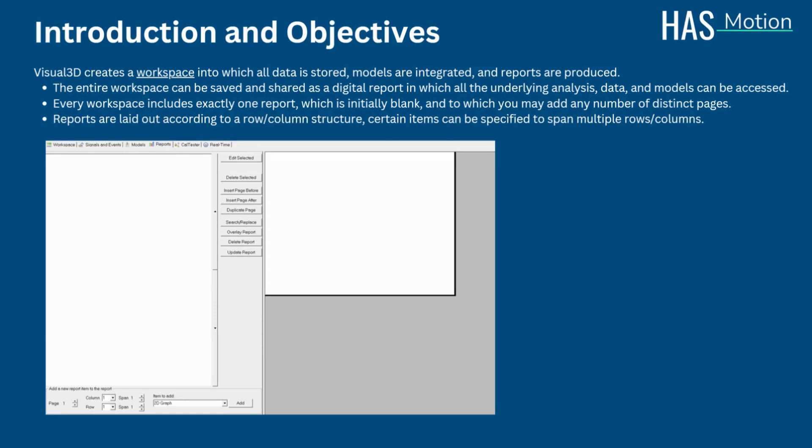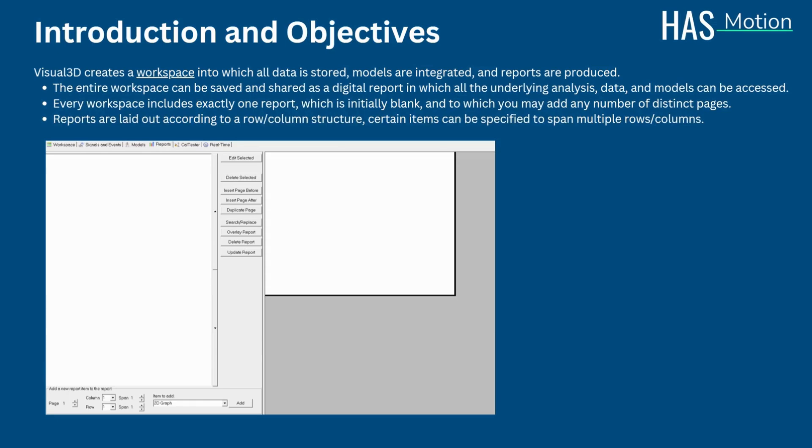Visual 3D reports are laid out according to a row-column structure. Each report page can have a distinct number of rows and columns, and you can specify that certain items can span multiple rows or columns. Items which can be included in reports include graphs, tables, graphical representations, for example, gait analysis metrics such as step length and cycle time, subject and laboratory information, and bitmap images imported from other programs.